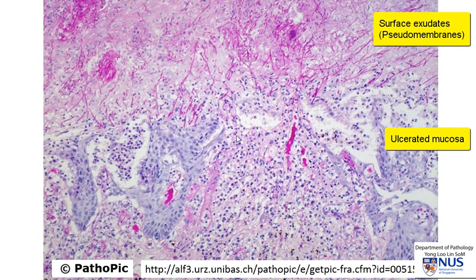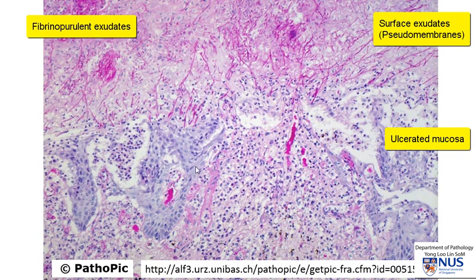You can see the mucosa is ulcerated and there is some associated acute inflammation with fibrin — hence fibrinopurulent exudates. And the residual mucosa shows some reactive changes.